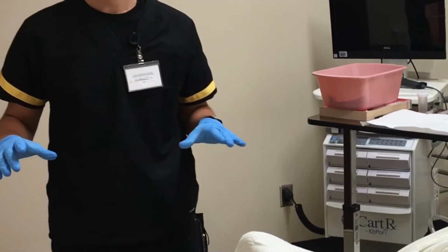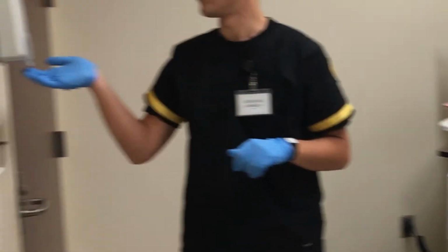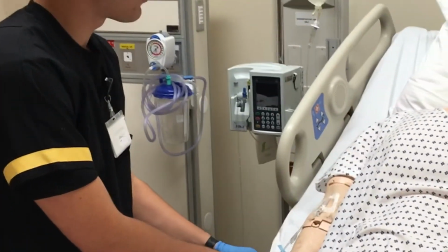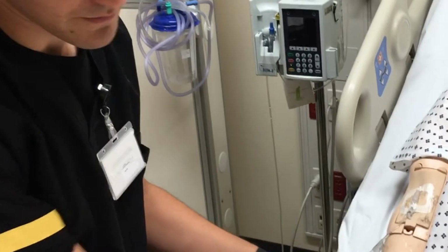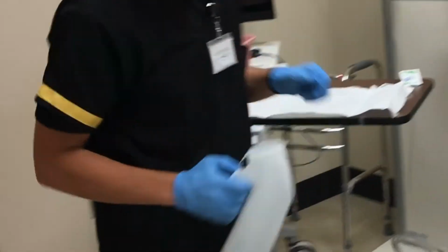So a couple days have passed, and I now have orders to remove the urinary catheter. So I'm going to come back in the room, hand hygiene. Hey, Kathy, I have orders to remove your urinary catheter. Can you please confirm your name and date of birth for me? Alright. Well, let me go put on some gloves, and I'm going to empty your urinary drainage bag here.